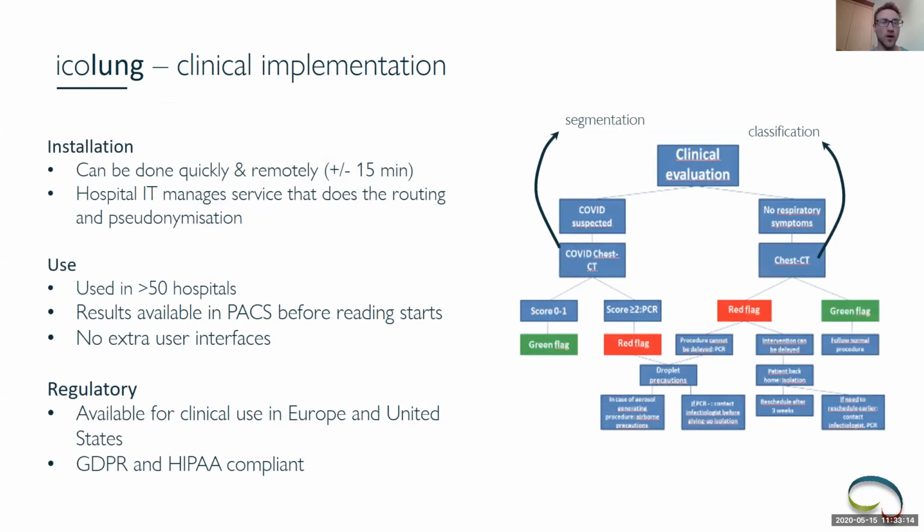Of course, when bringing software into a clinical routine, it's much more than designing and developing the AI algorithm. If you have this algorithm, you need to properly validate it and also write a dossier for regulatory approval. In Europe, this is called the CE marking, and there you send this dossier to the notified body.